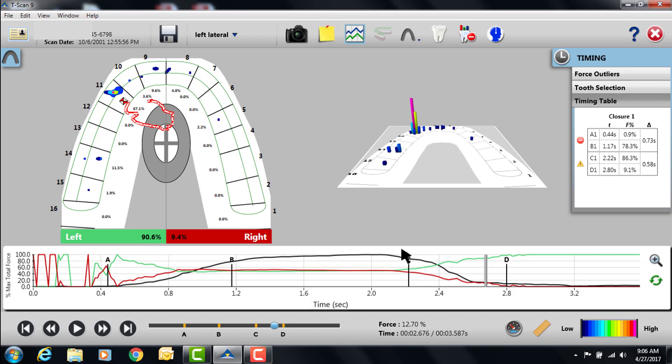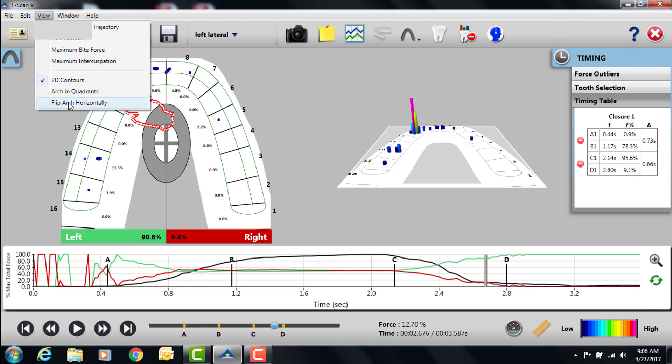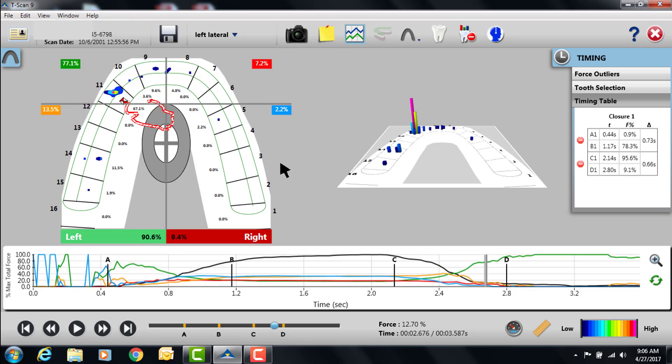Okay, so I want to talk about setting the C to D lines. Many times a computer will do a very good job of setting them, but people like to be as accurate as possible. So what we recommend is when you get an excursion, go up to View, go to Arch in Quadrants.